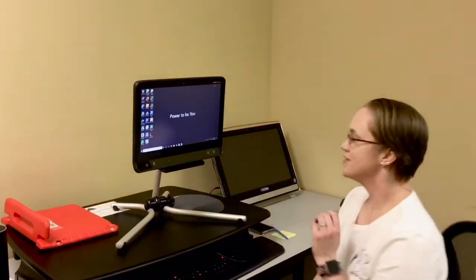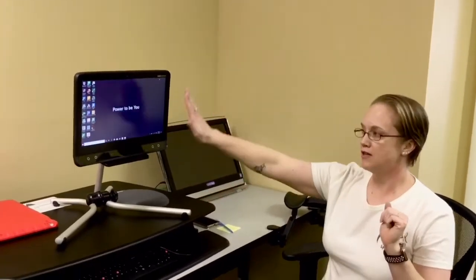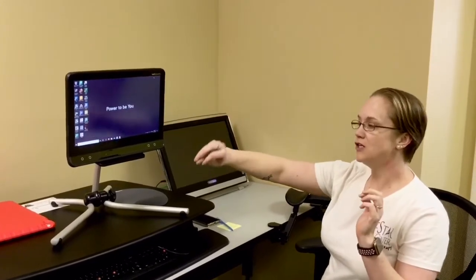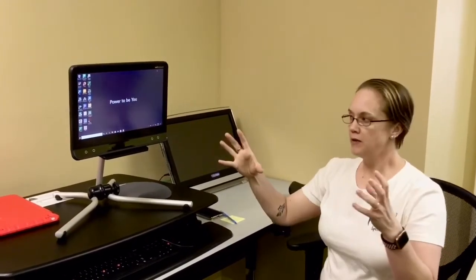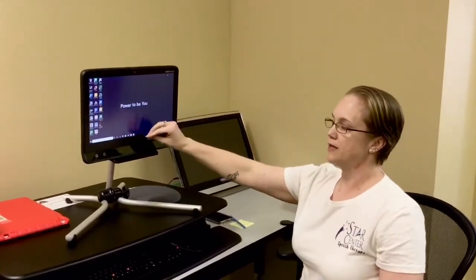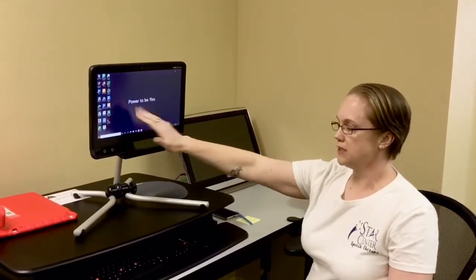Okay, so that is Windows Control. It will work everything on the desktop and most of the apps. I'm going to open up the Snap Core first, and you'll see it's a little different. I don't have to open up all of the controls. So on Windows Control, you saw when I looked at something, it opened up some other controls for me to double click, single click.